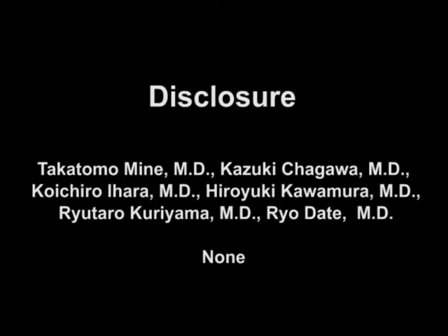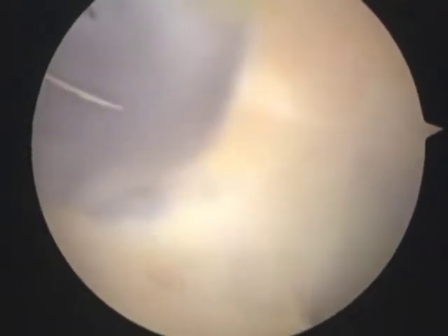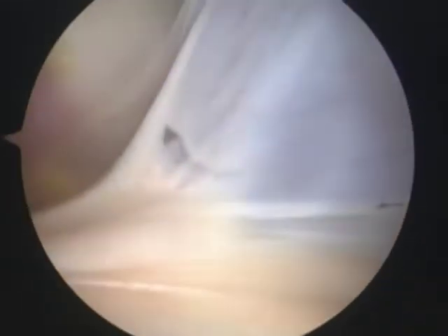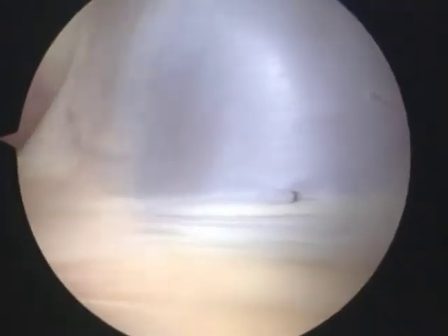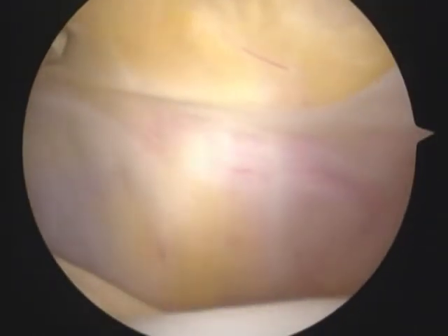Right knee arthroscopy is performed through a routine antilateral portal. Here we can see a complete suprapatellar plicae above the patellofemoral joint. A type A shelf is found in the medial joint wall.